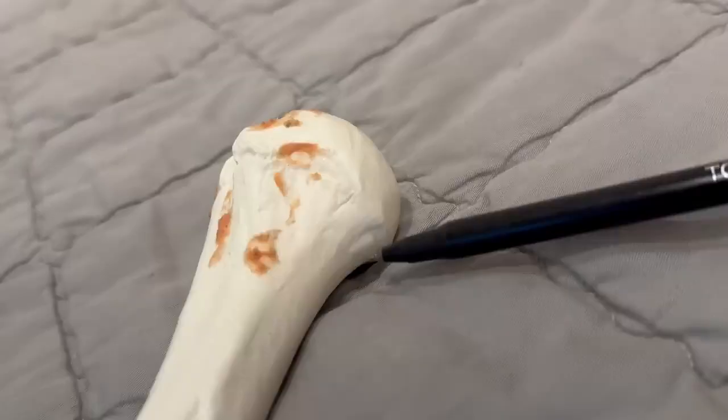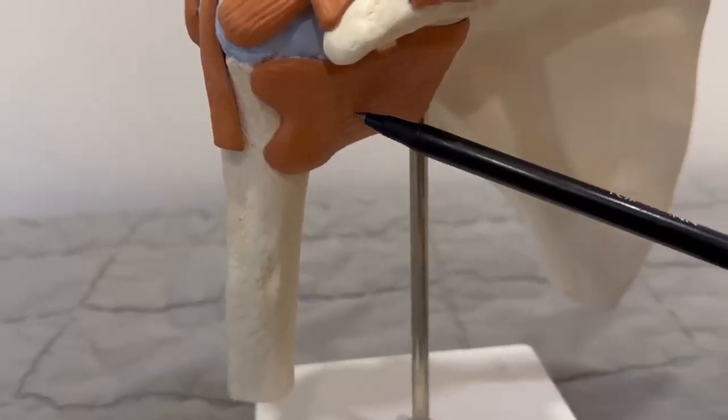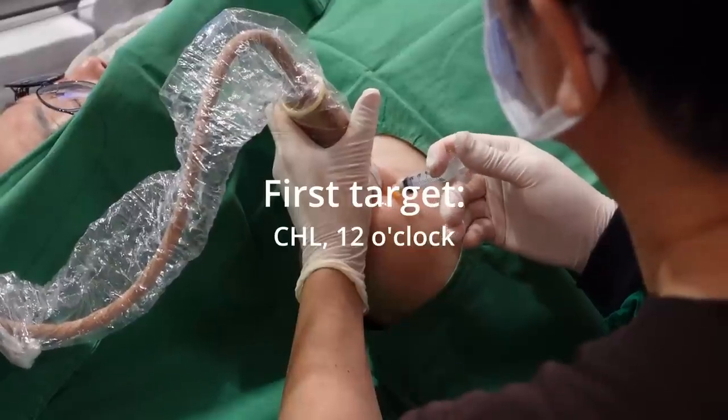This area is the anatomical neck of the humerus head and the humeral attachment site of the inferior capsule. This approach is similar to the C-arm guided subscapular nerve technique, but the target is lower than in the C-arm guided procedure. This altered target is due to an inherent limitation of the ultrasound guided procedure. With these targets, I can relieve the tightness of the capsule in severe osteoarthritis, improve pain, and increase the range of motion. I will show several clinical cases.